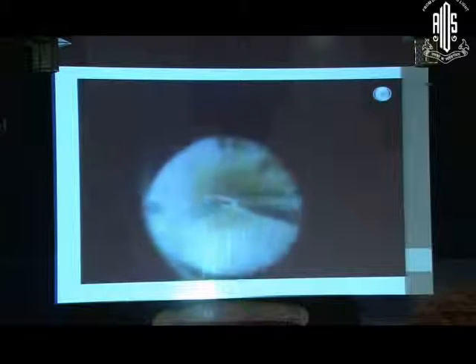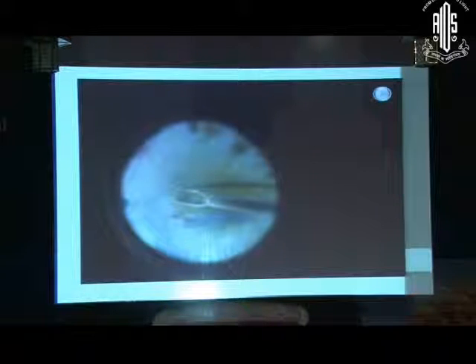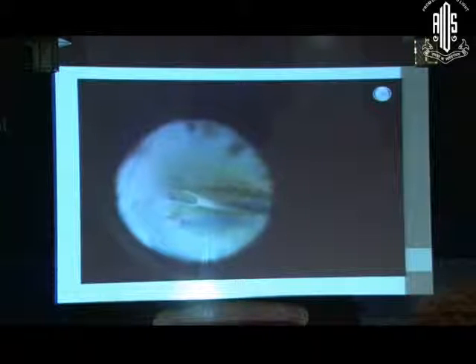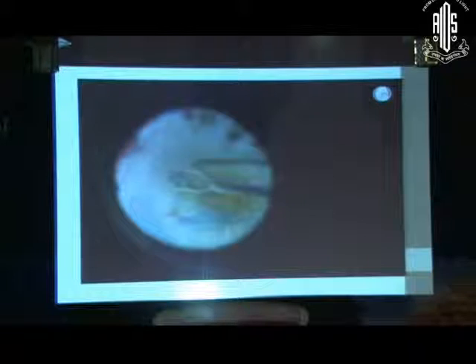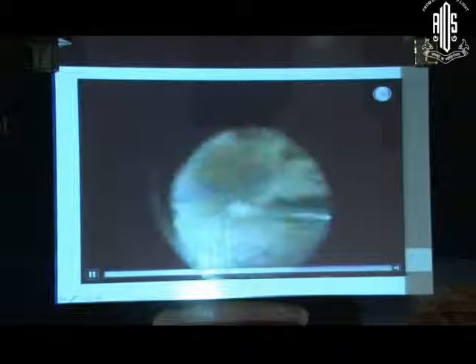One approach is fovea-sparing ILM peeling. Here is a diabetic patient with a large cystoid space. We do a fovea-sparing ILM peel — going all around gently and stopping when we reach the area of cystoid spaces. This prevents de-roofing of the cyst wall, which would cause a lamellar or total macular hole. We come all around and cut off the excess ILM using a cutter.